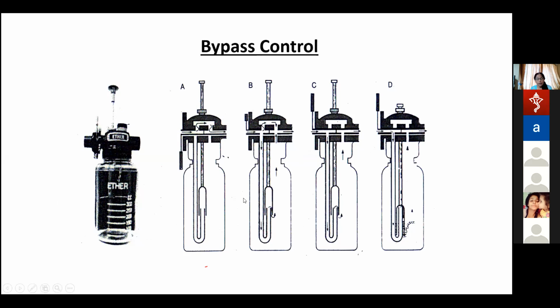But if the patient has to draw in gases from here, it is very difficult because inspiratory resistance will be very high for him to draw in liquid anesthetic agent by his inspiratory efforts. Even if you want to control breathing, you have to put in so much high pressure for ventilation because the gases have to be pumped through the vaporizer. So these systems are called plenum vaporizers, meaning trilene bottle, ether bottle, your Fluotec Mark II, all Tec vaporizers. They are all plenum vaporizers. They cannot be used as draw-over.